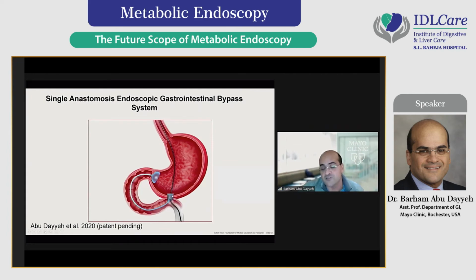Using endoscopic ultrasound, this is a work in progress that we've been doing, where we created a device that would isolate the duodenum. And this device will allow us to now benefit from this endoscopic GJ in order to introduce significant metabolic benefit by targeting gastric and small intestinal pathways.